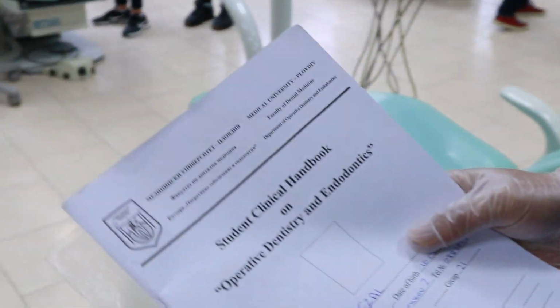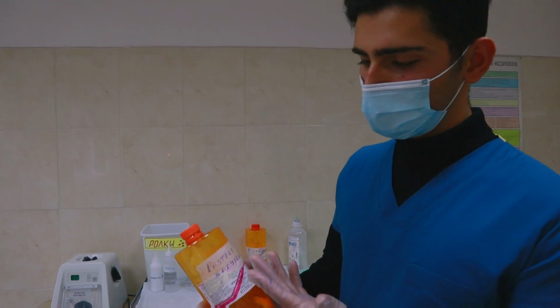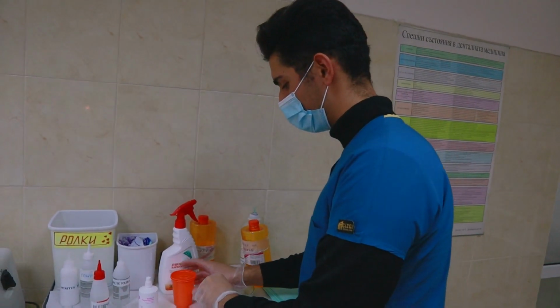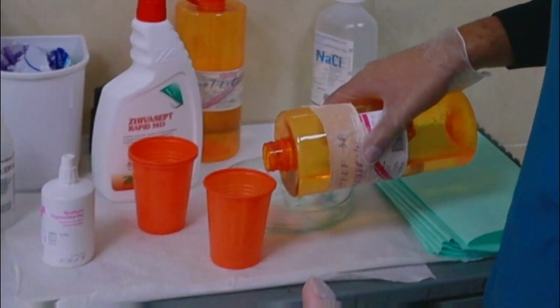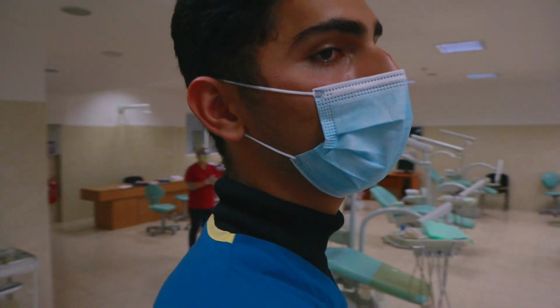As students, we need to document all of our cases in this book. Book for operative dentistry and endodontistry. We start by giving our patients an antiseptic solution, which needs to be swished around in your mouth for a minute. You grab a cup, pour some in there. It's just enough for the patient to swish around their mouth for 1 minute, and then after that we can begin the oral checkup and any sort of treatment we need to. So come, let's give it to the patient.